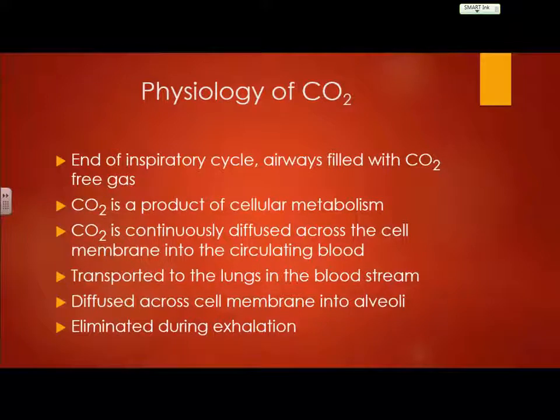At the end of the expiratory cycle, the airways are filled with CO2-free gas. Why? At the end of the inspiratory cycle. Huh? All right. End of inspiratory. That's right. You just breathed in and you just filled up with oxygen. The ambient air that we're breathing in right now, we know has 21% oxygen, mostly nitrogen, right? And then some other trace elements, right? And so at the end of the inspiratory cycle, as we're breathing in, there's no CO2 there.